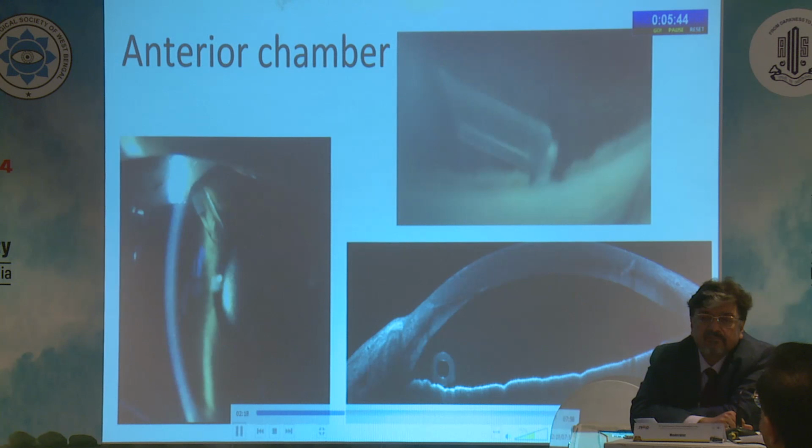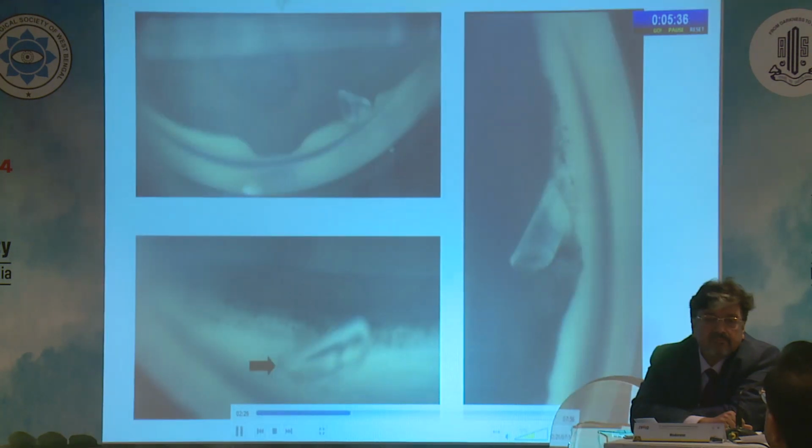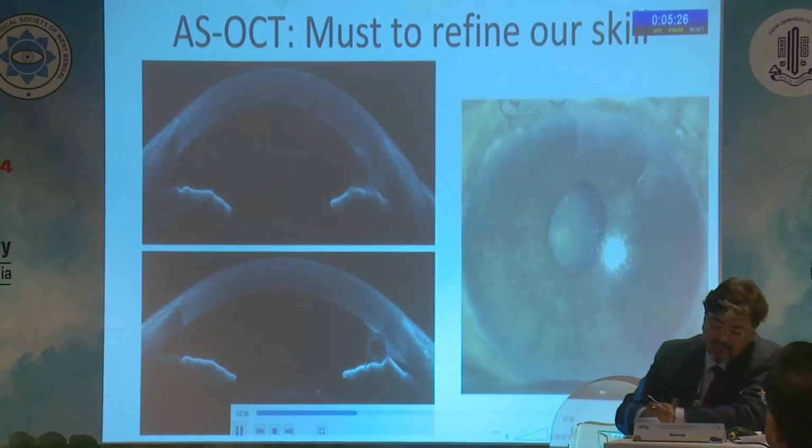These are some of the suboptimal entry points for the anterior chamber tubes. Note the focal tube corneal touch in these images. Gonioscopy of the tubes will also help us to find the exact entry points of the tube. Note the quite anterior location of these tubes. Apart from slit lamp and gonio, ASOCT will also help in understanding the dynamics of the tube in the eye.